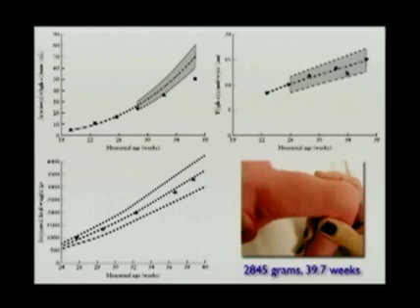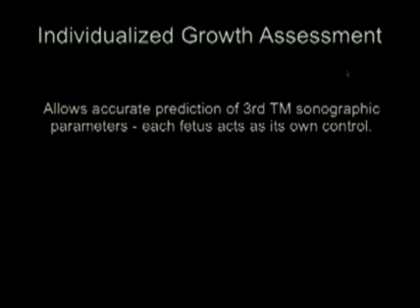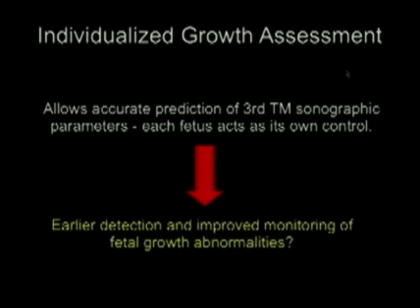So, this goes back to the concept of what really constitutes growth, and the fact that growth is not really simple. When you talk about fetal growth, are you talking about the weight? Are you talking about skeletal growth? Are you talking about soft tissue development? It's a very, very complex topic. So individualized growth assessment allows accurate prediction of third trimester sonographic parameters where each fetus acts as own control, and it may provide earlier detection and improved monitoring of fetal growth abnormalities.